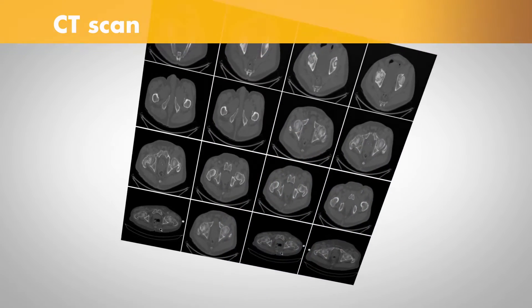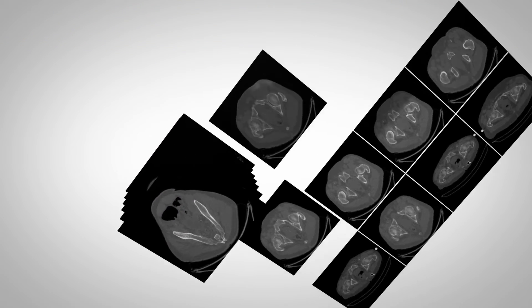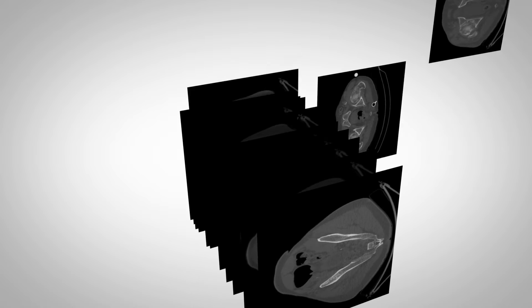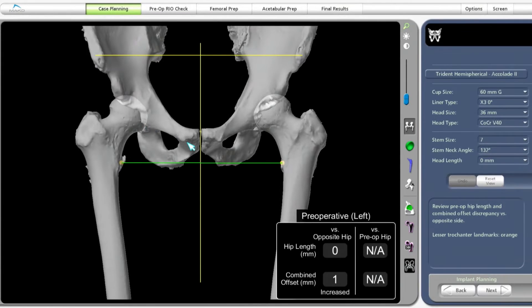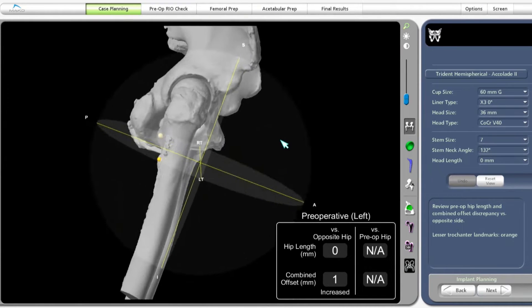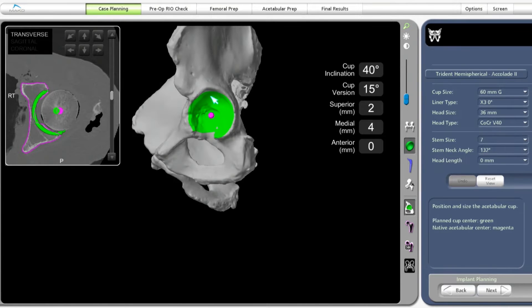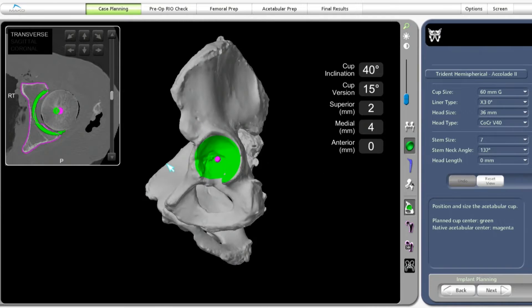It begins with a CAT scan or CT scan of the hip joint. A CT scan is a series of x-rays taken at different angles that can help surgeons see things that they can't typically see with an x-ray alone. The CT scan data is used to generate a 3D virtual model of the patient's unique anatomy. This virtual model is loaded into the Mako system software and is used to create a personalized preoperative plan.